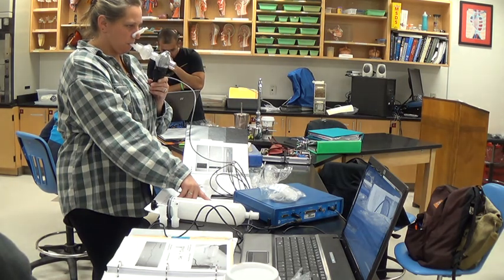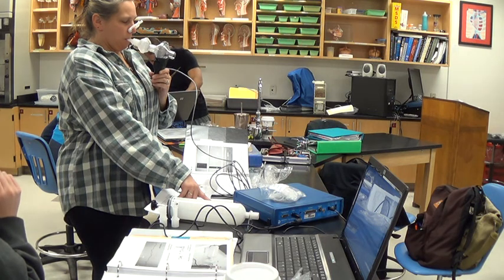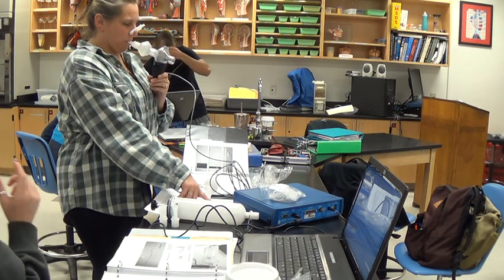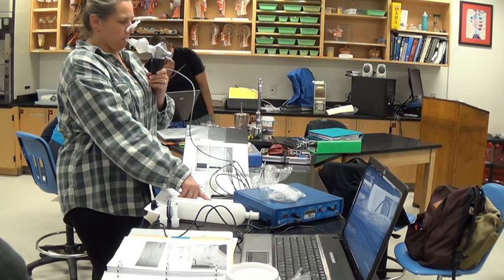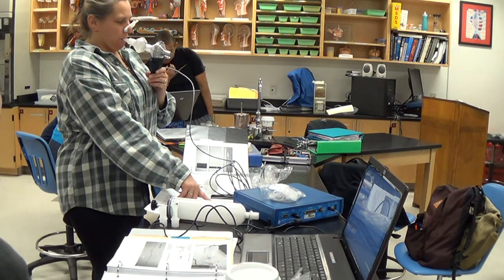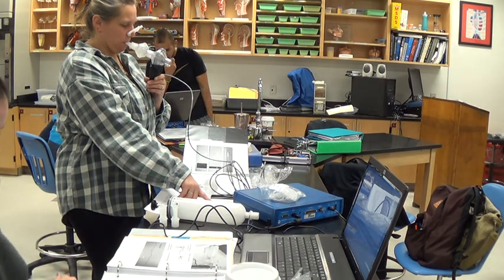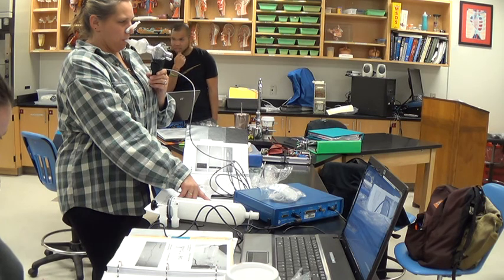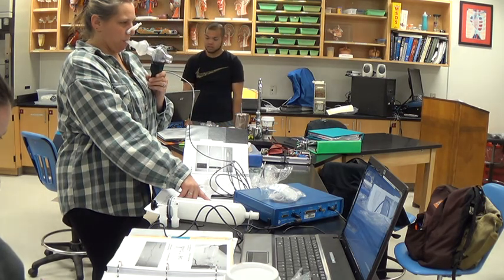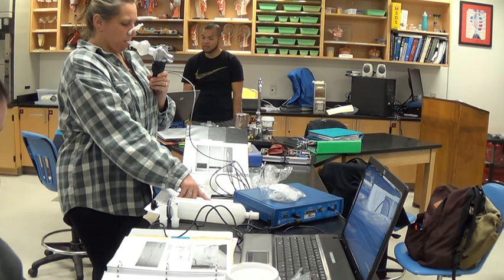Okay, so at 1 second, you had... We've got to get closer though. See if you can get as close to 0.9 to 1 second as possible. And then go from the top. It's supposed to go from the top, at least that's what it said. You're blowing air out, so you're seeing how much you can blow out. So start from the top and go 1 second.